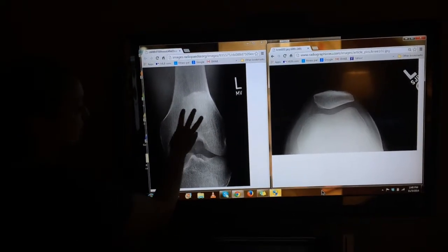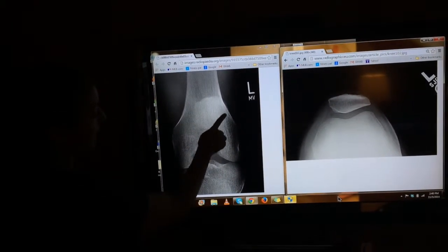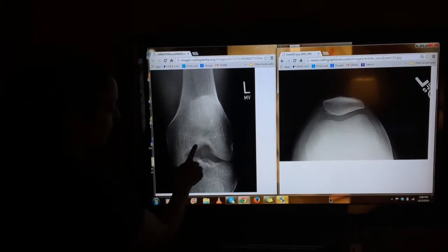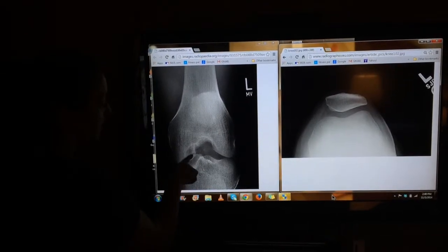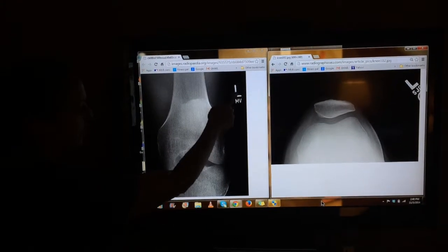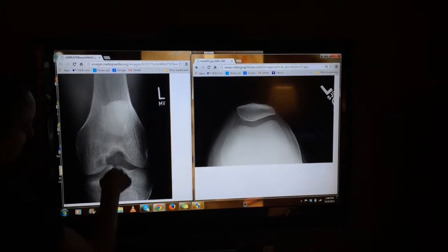Because it is due to the view, we angle the patella off the joint, so the apex is no longer covering the knee space. It's not superimposing the knee space, which is great. And this is a great view, and there's my marker. And great collimation, a little above and a little below.